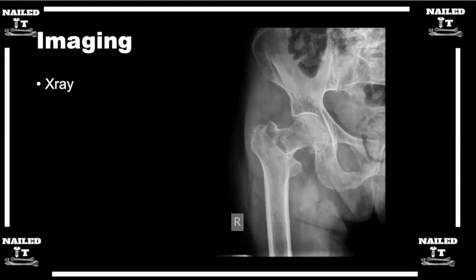It looks to me like this is a more basicervical type of injury, so I would personally treat this a little bit more as an extracapsular fracture. You see a little bit of greater trochanter involvement as well on that x-ray. The lateral view is going to be really important to understand what's going on in the anterior-to-posterior plane when it's time to get a good fracture reduction.